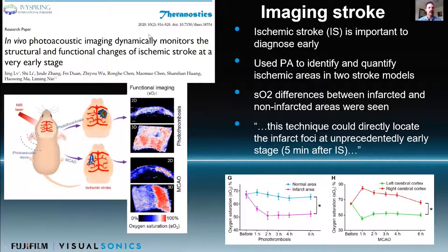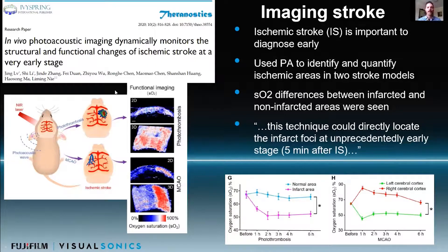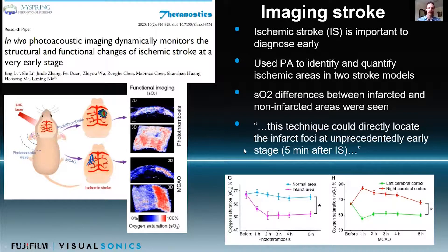More recently, last year, there was a study done with two different types of stroke: a photothrombotic stroke, which was much more localized, and a middle cerebral artery occlusion model stroke where basically the whole hemisphere was knocked out, similar to what we were doing with the common carotid artery ligation. Photoacoustics was able to image in the cortex and really identify that focal stroke with the photothrombosis, or the more general less-localized stroke with the middle cerebral artery occlusion, locating the foci of the infarct at a very early stage.